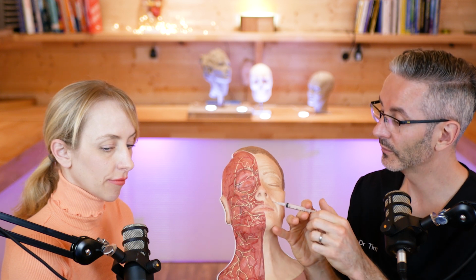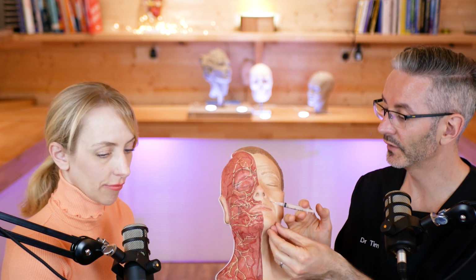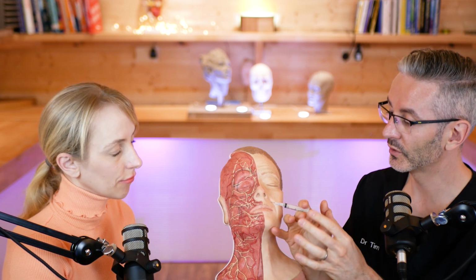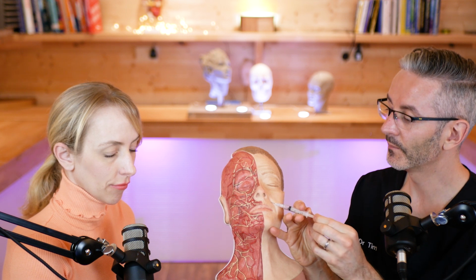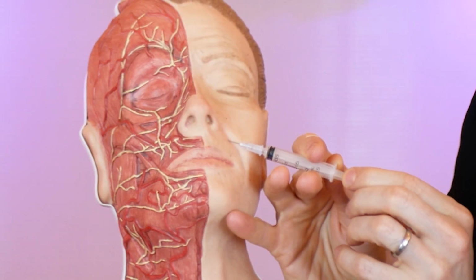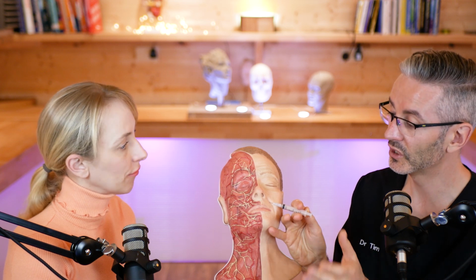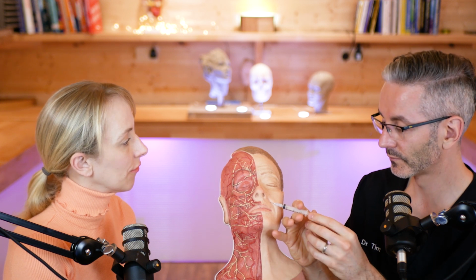If all of this is locked in place, so I'm stable at my wrist, I've stabilized my fingers, even the only bit that's moving here, I'm actually resting. In the case of a periosteal injection, you've got one more place to rest, which is on the patient's bone, basically. Sounds terrible, but it doesn't actually hurt that much. And then you aspirate. You can see that needle tip is not moving much at all. So that's a meaningful aspiration. Then I can inject, and I know that at the point I've aspirated, I can inject more safely than without aspirating. I can say it that way.